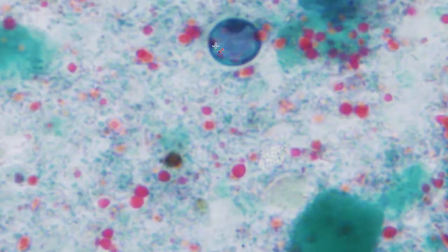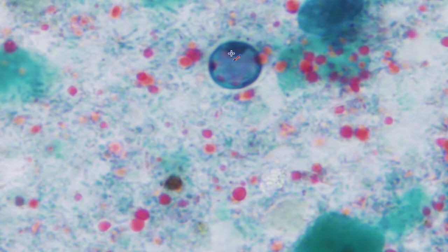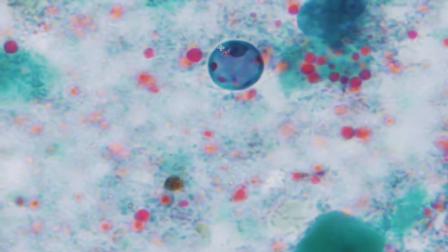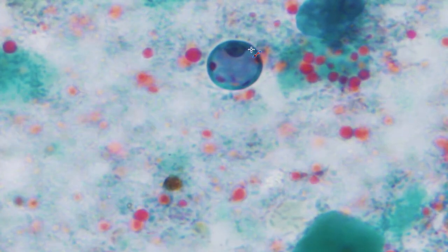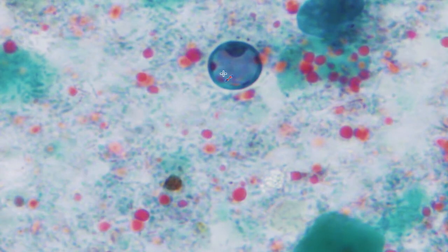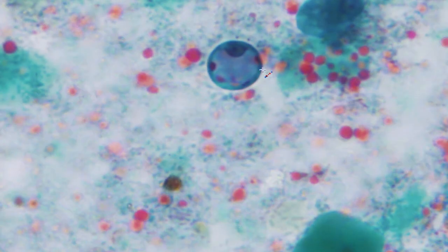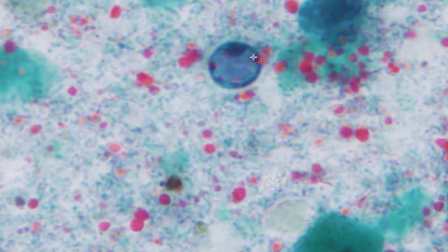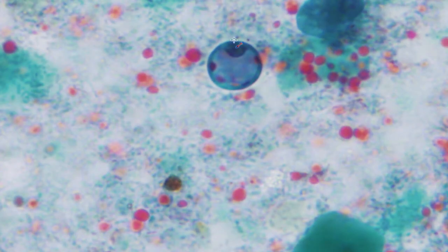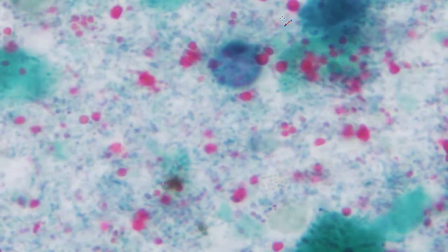This is an interesting thing. This is a pre-cyst, so it's only got one nucleus. I've seen a lot of these, and I used to wonder what was going on with my stain, if I'd made a mistake or something had happened in the preservative for this to happen. This is simply, it's just recently become a cyst, and it's still got a large glycogen vacuole in the center. So this is actually a recently encysted trophozoite or pre-cyst. And they do have this situation where the glycogen vacuole can push the nucleus to one side. Occasionally you'll see binucleate ones. That's just something which happens in that early stage, and that'll go away. So when you see that, don't get concerned, it's just normal.